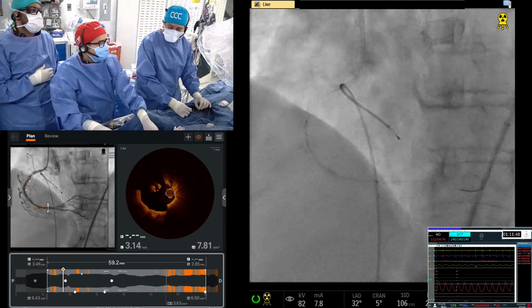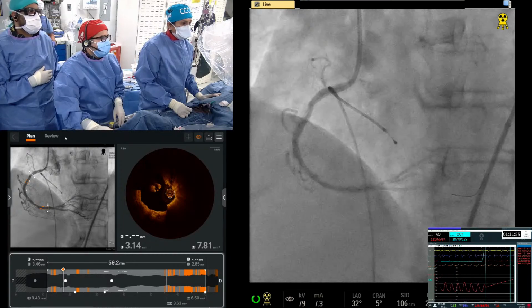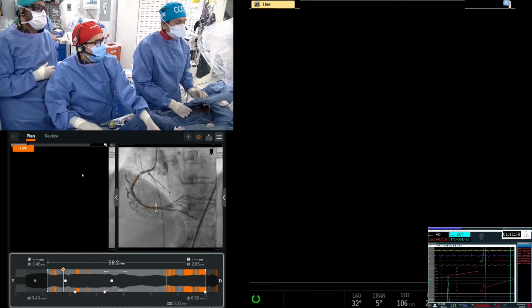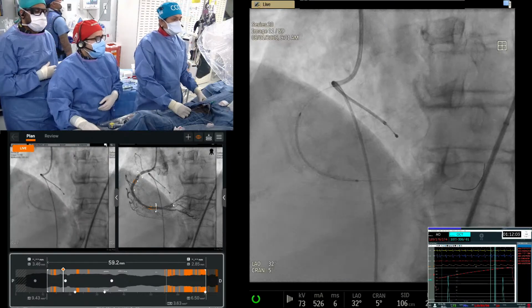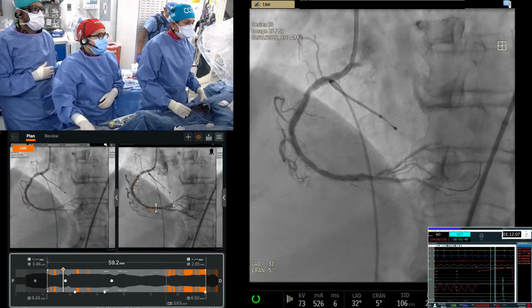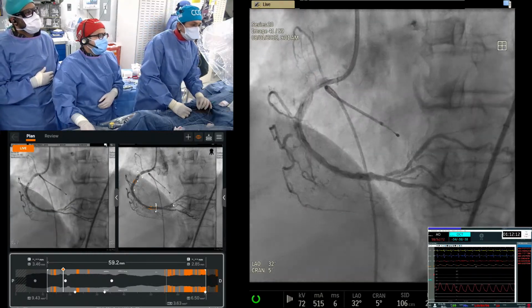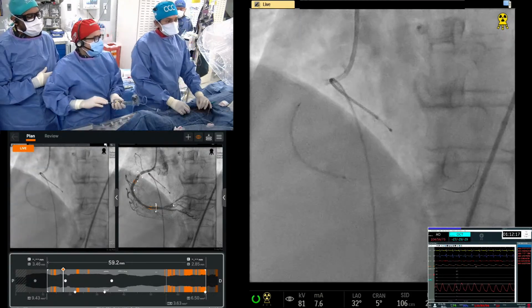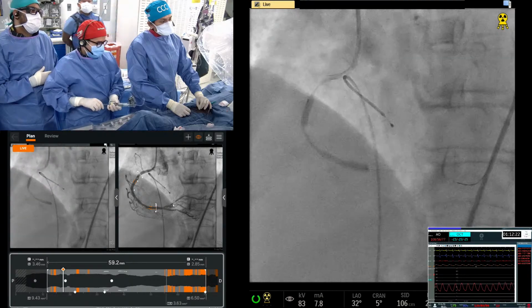Okay. Deep breath. You want to take a cine? Yeah. Some dye. Okay. You think 48 is not covering? It is. Okay, let's take a cine. Confirm. Go. Which vendor is that? This is Abbott. Right at the mark. I think if I pull back a little bit, then we may even need a shorter stent proximally. I think we are good here. Agree? Yeah. Okay, we may not need an 18, maybe a 15. We'll have to post.